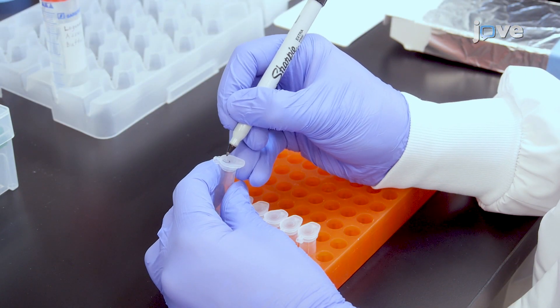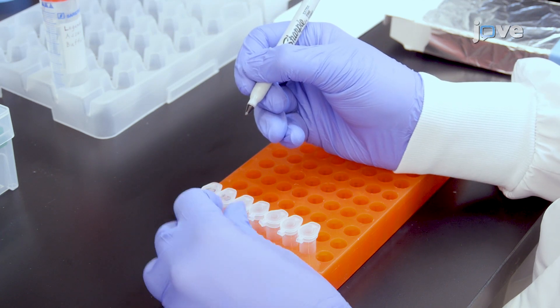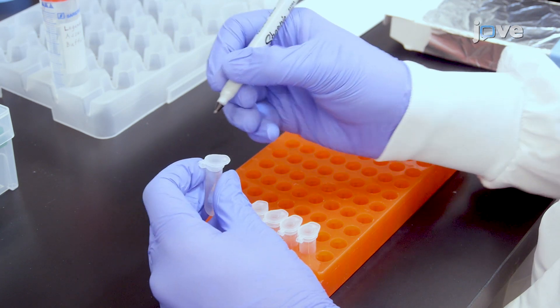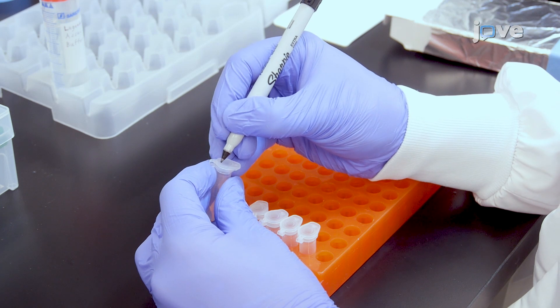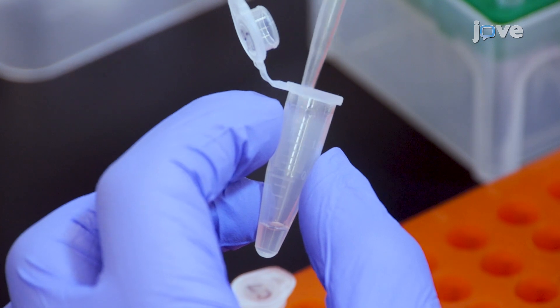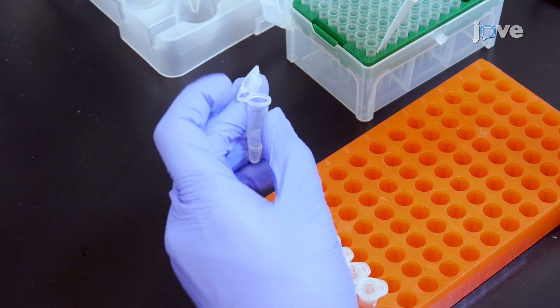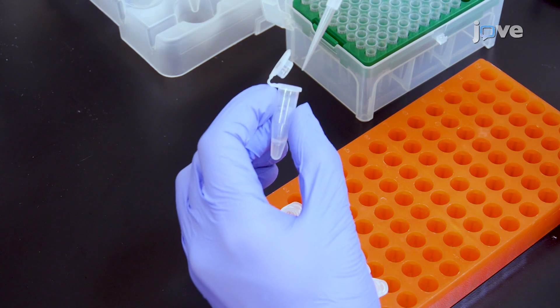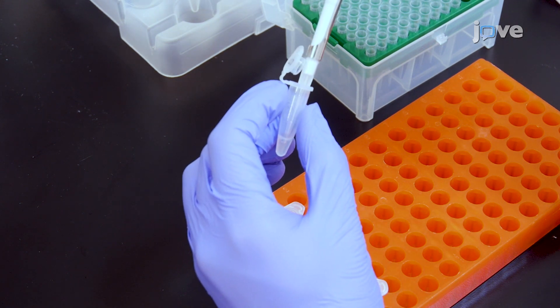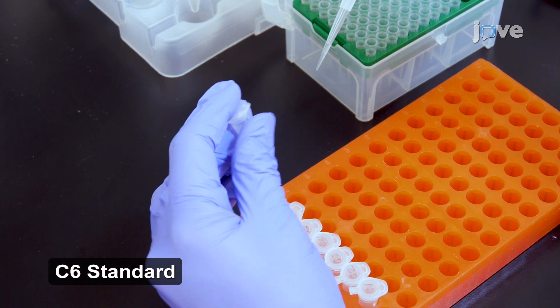Label six polypropylene microcentrifuge tubes as C1 through C6. Add 75 microliters of assay buffer to each of these tubes. Then transfer 25 microliters of the top standard C7 to the C6 tube and mix well by vortexing. This will be the C6 standard.